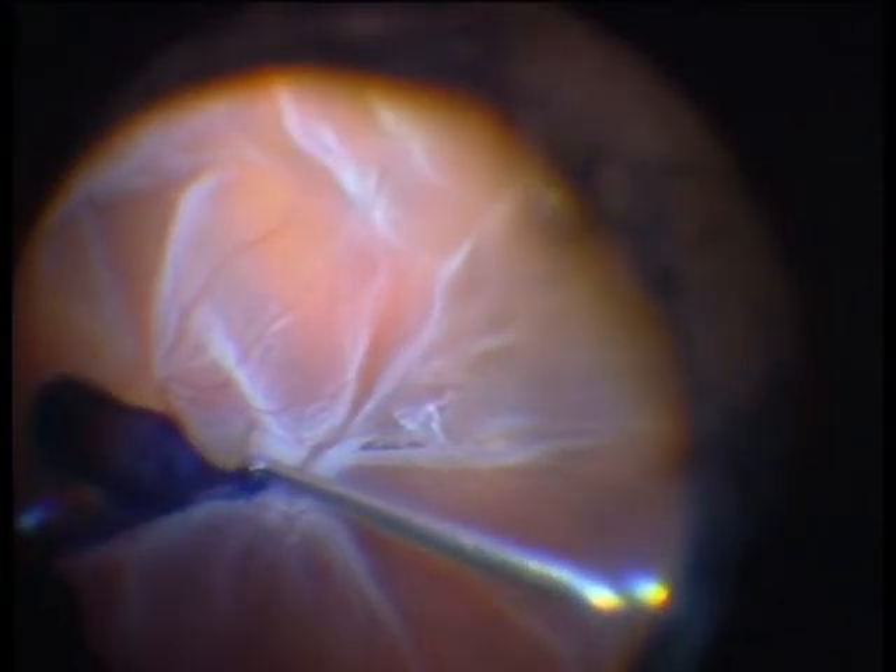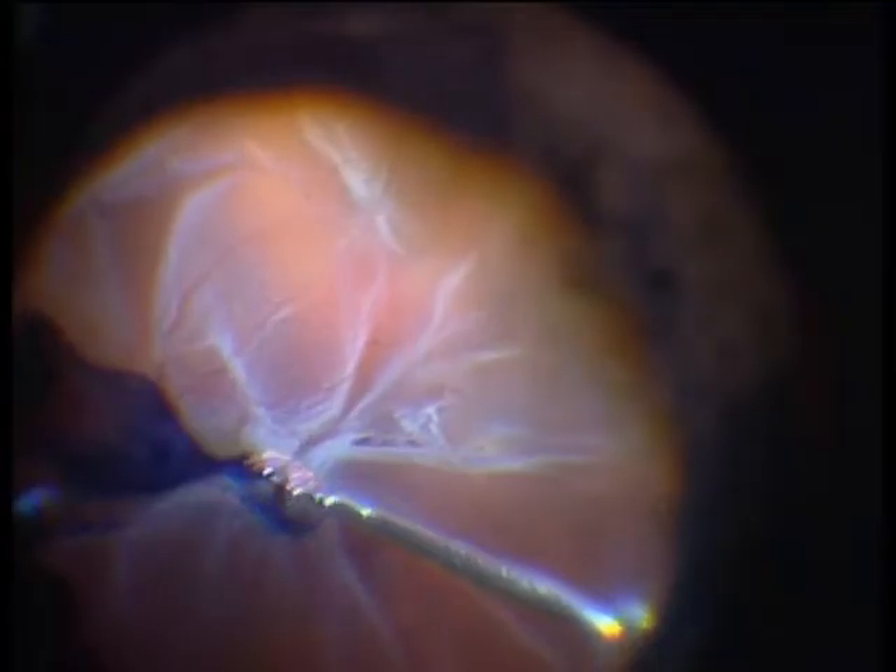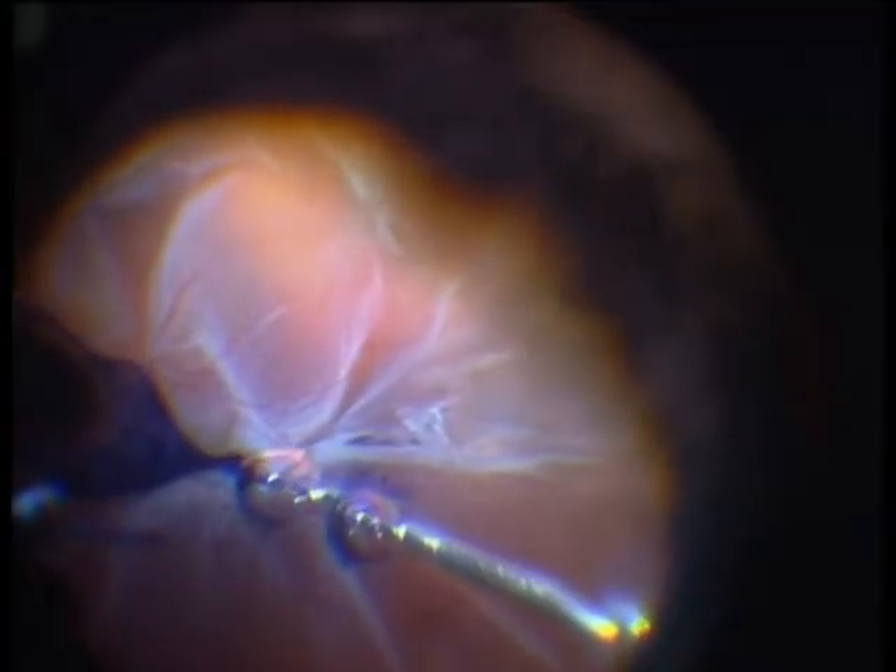The most striking point actually is the tractive component in the macula. I am staining the macula with Membrane Dual from Dorc. Here you see the membranes which have to be removed before we can proceed with surgery.